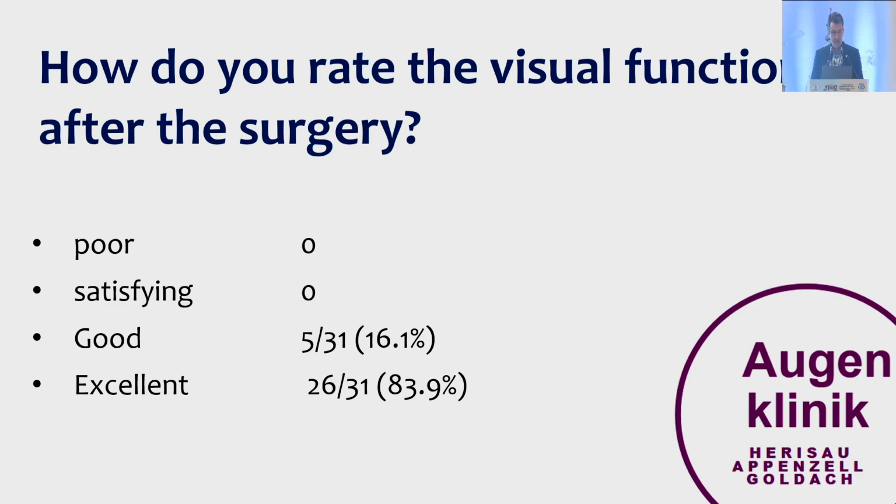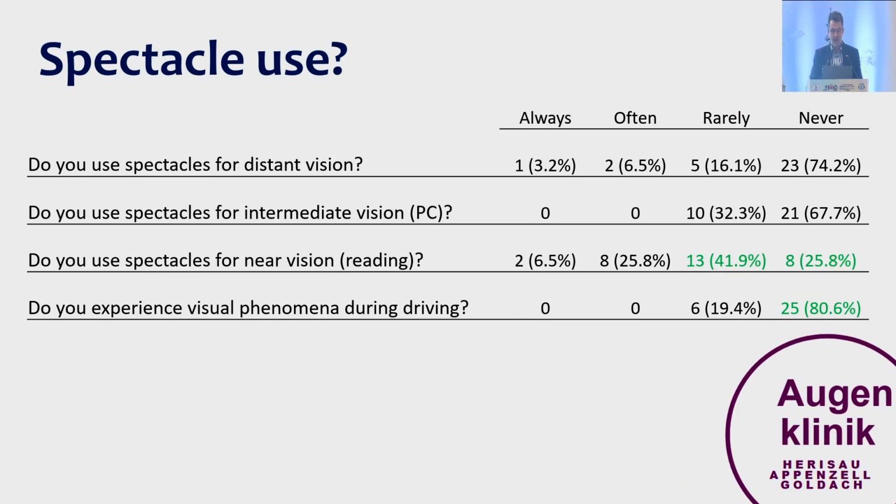And all the patients responded good or excellent. And now the important questions are, do you use spectacles for distance vision? Do you use spectacles for intermediate? This is computer. Do you use spectacles for reading? And do you experience visual phenomena during driving? And the important numbers are highlighted in green.